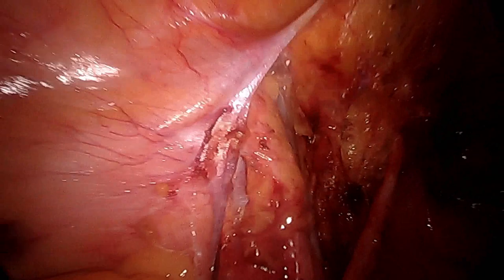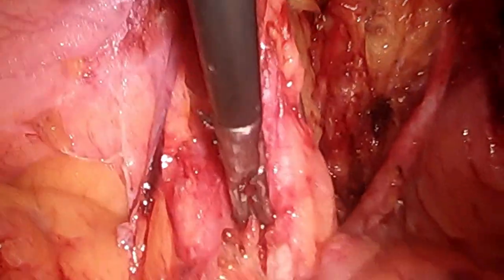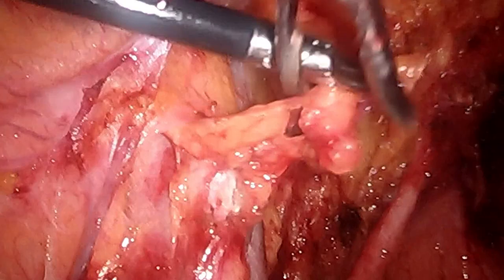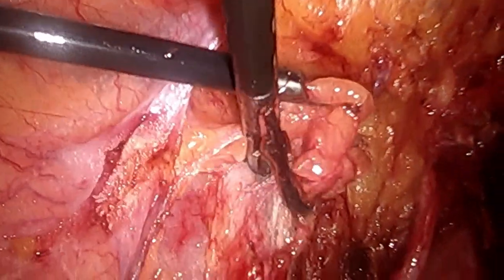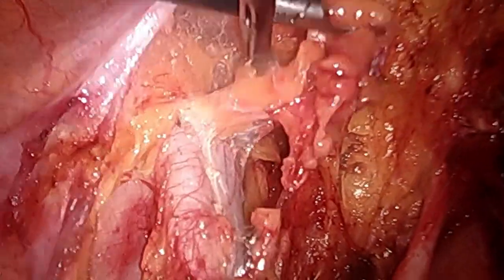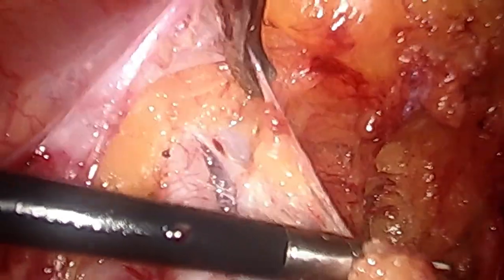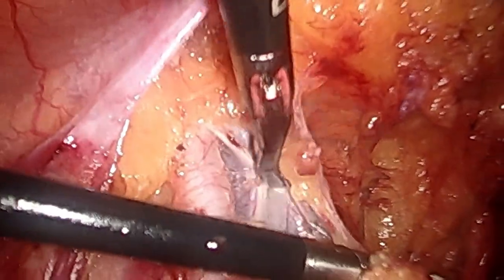We had already done the hysterectomy and dissected the lymph nodes on the right side, so we proceeded to dissect the lymph nodes on the left side. As you can see, the ureter is totally dissected and the uterine artery is ligated at origin. We were starting to dissect in the area of the psoas muscle, taking the external and internal iliac lymph nodes, when while trying to release this lymph node from the vessel we accidentally nicked the external iliac vein.